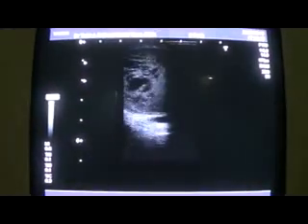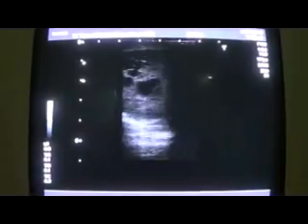So this is the study of the cystic areas relating to the right testis of this 37-year-old gentleman. The cysts are seen almost everywhere, from very small, maybe pinhead size, to this tiniest one I can see.